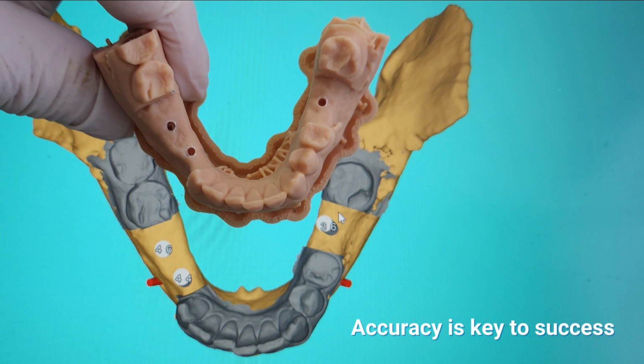Okay, what we can say is that the accuracy is of course very important, but the accuracy is linked to the surgical guide. But the advantage of working with an open flap and guided at the same time, laying on the teeth, will avoid contamination of the implant when you place it through the gum. So this is very important. And in some cases, you may lose implants because you are placing the implant which is contaminated through the soft tissue. So this technique developed by Arshad Alam will allow avoiding that and making more secure implant treatment.